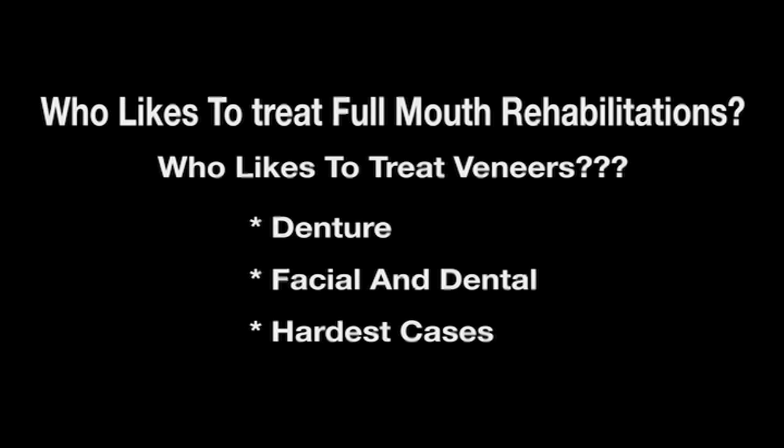principles. With those solid denture principles, we can take a patient who comes to us with significant advanced periodontal disease, as demonstrated on the left-hand side of this slide, and bring them back to their youthful appearance, as demonstrated on the right-hand side of the slide, by providing them with proper facial aesthetics, along with tooth position to give them a harmonious smile with their face. And all of this has to be built within the boundaries of their vertical dimension.